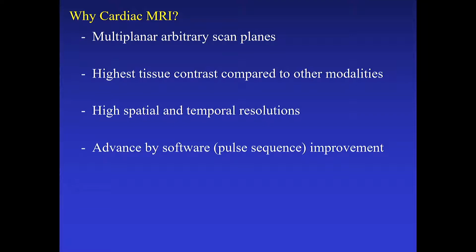Another strength in cardiac MRI is that there are many pulse sequences, which are the software of the MRI method, that are constantly being updated or invented and allow the technology to move forward in uniquely assessing the heart in different ways.